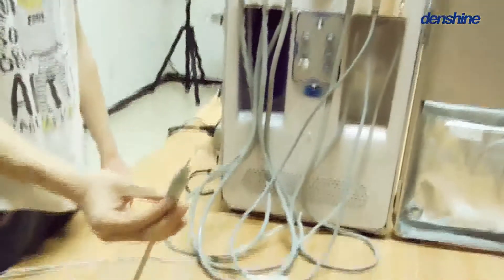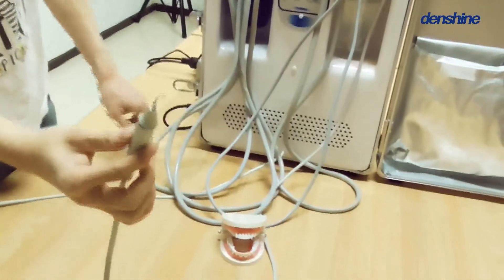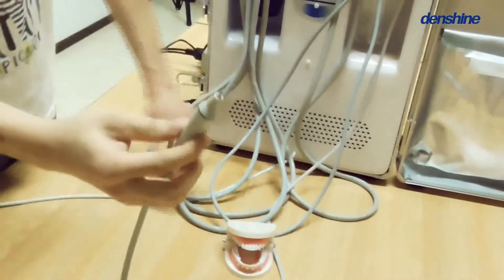And finally, the ultrasonic cleaner. I'll use these dental teeth to demonstrate it.